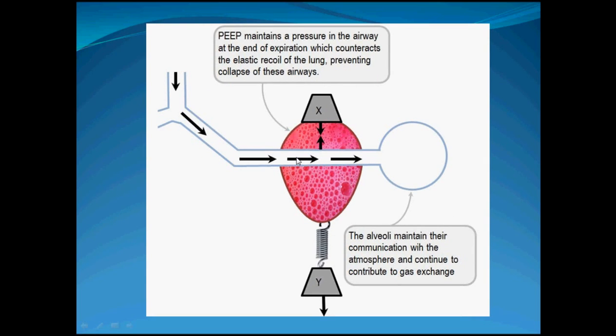When you put a PEEP, this means that you are adding some volume, which means that you are adding some pressure to keep these alveoli and respiratory bronchioles open.